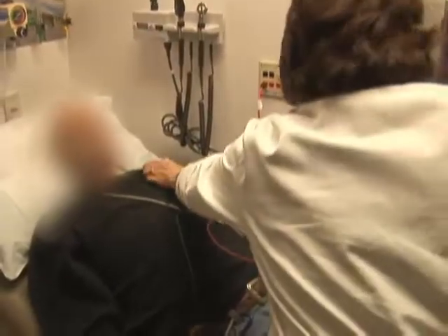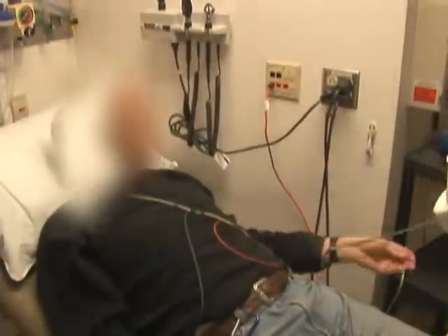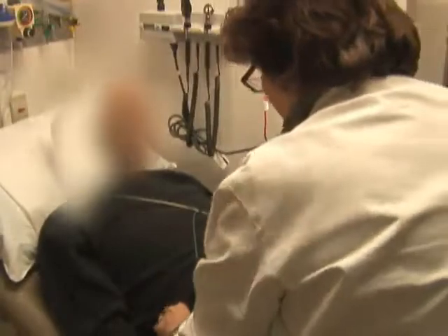The wand and telemetry electrodes are removed. The session is ended and the pacemaker interrogation is finished.